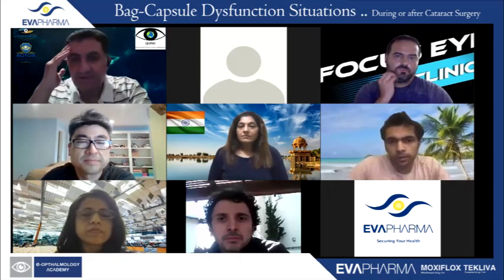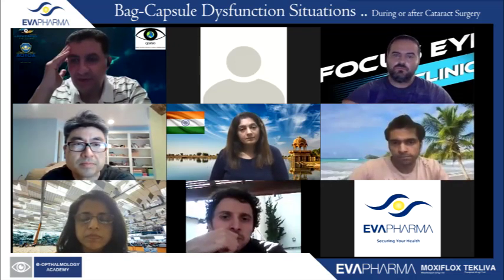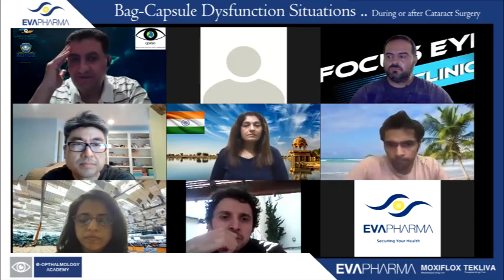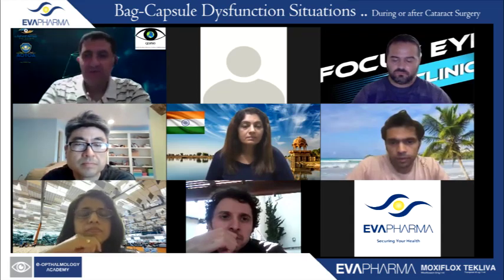Yes, I put some dispersive visco before I did the irrigation aspiration, but I felt there were some strands of the vitreous, so it made me continue.